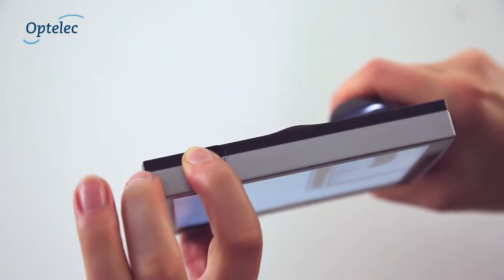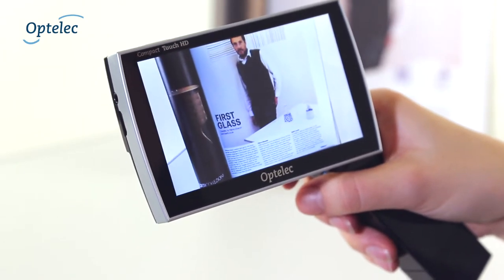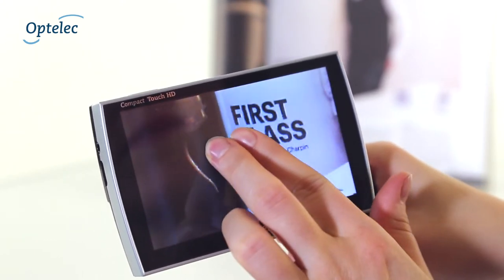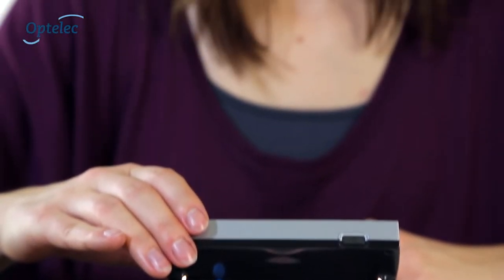To read information at a distance, simply press the on-off button and freeze the image. When the image is frozen, you can still adjust the settings. Plus, you can use two fingers to easily pan through the frozen image.